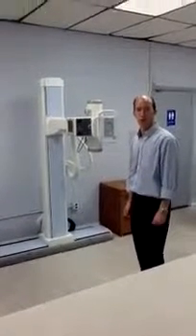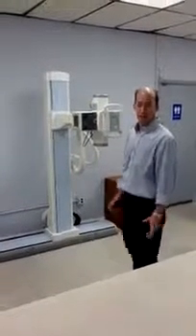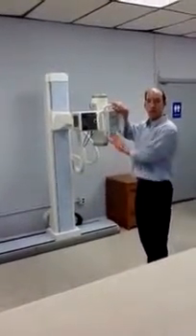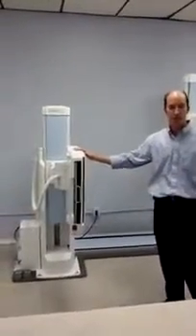Hi, this is Kevin from Summit and I'm over here in the AMRAD showroom today to demonstrate the movements of the FRS system, or the floor rail system. The FRS system consists of two components: a tube stand which is manual movement, and a motorized receptor which is completely motorized.